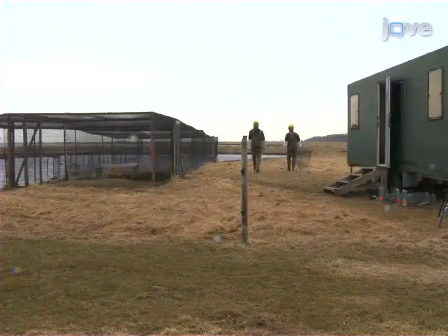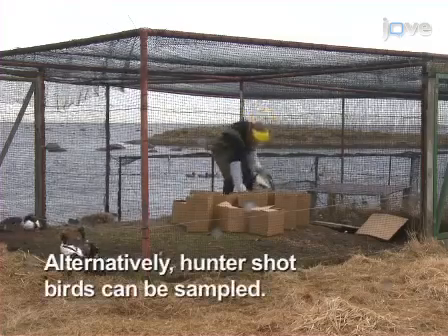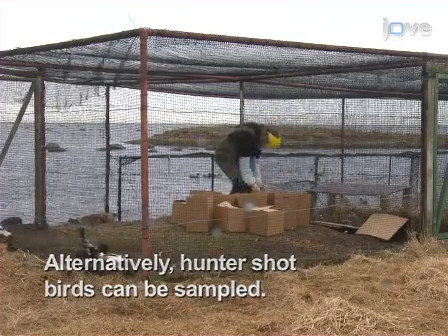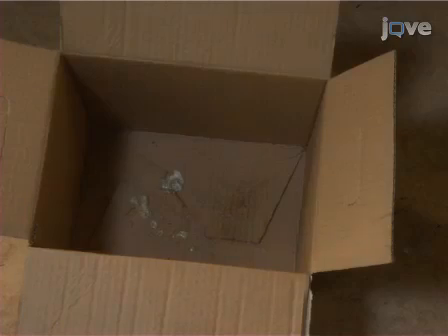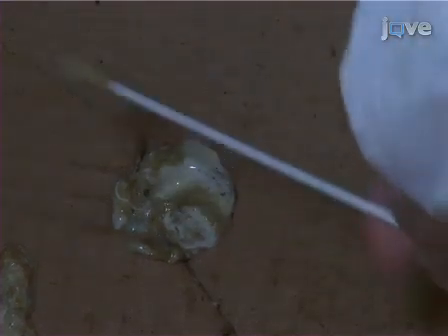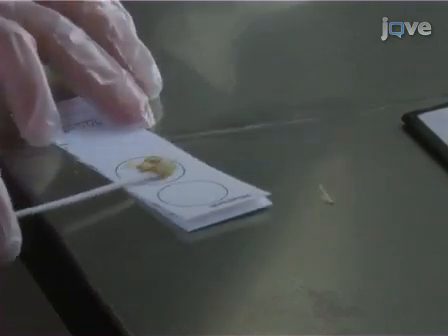Trap dabbling ducks or other birds in a cage by attracting them with lure ducks or food. Here, ducks of the genus Anas are trapped. Place the trapped ducks into individual cardboard boxes. Take the duck out of the box by holding its wings tight to its body. In most cases, fresh fluid droppings will be present at the bottom of the box. Using a new sterile swab every time, pick up the droppings and apply them to a Whatman FTA card until the card target surface is soaked.